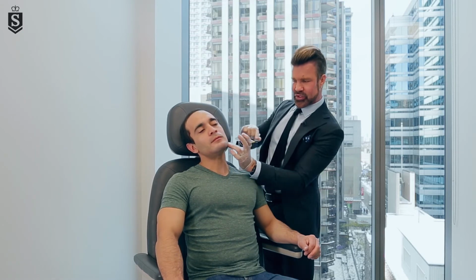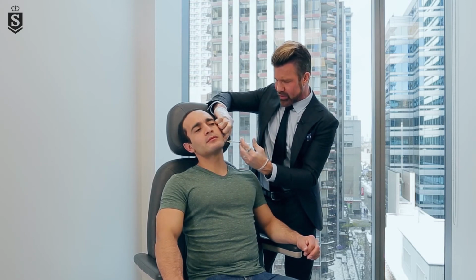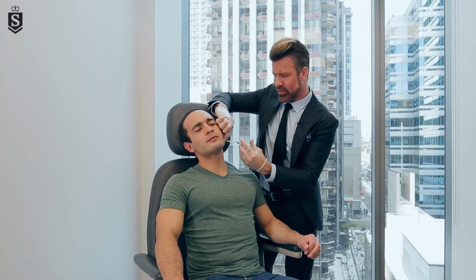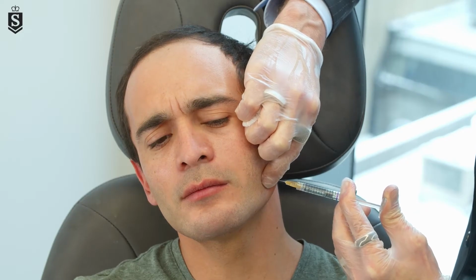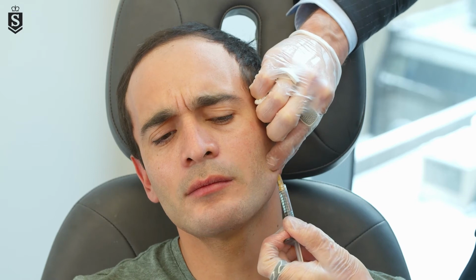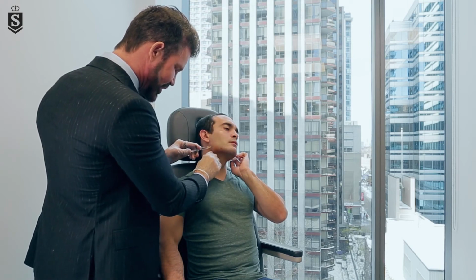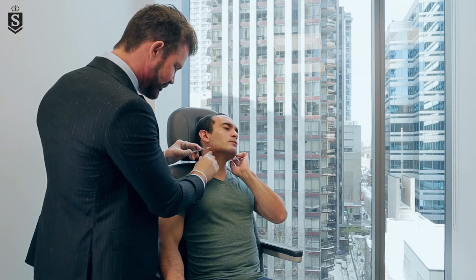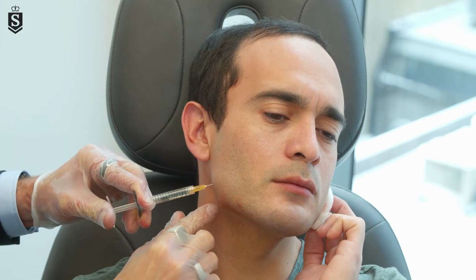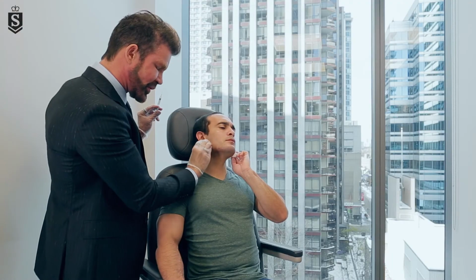We're just gonna square off his posterior jawline, and we're gonna use the same product. We're just gonna go just in the corner or the angle of his jaw. Create a nice little mound just to really define this part of the jawline so it feels a little stronger. And then we'll go vertically, just create a little bit of a depot here, a little mound right at the angle of the jaw. We call this the posterior jawline. And to really define it, we want to go up a little bit vertically again. And again, it really just gives some lovely strength to the corner of the jaw.